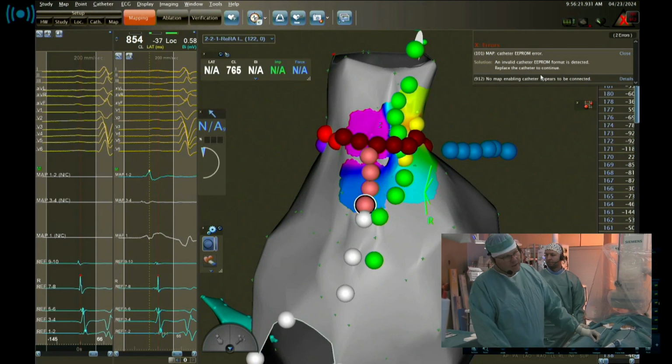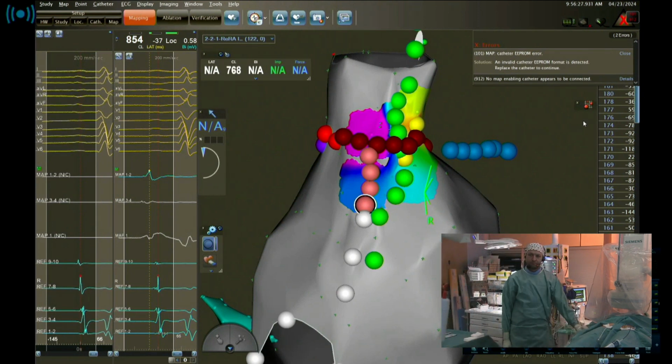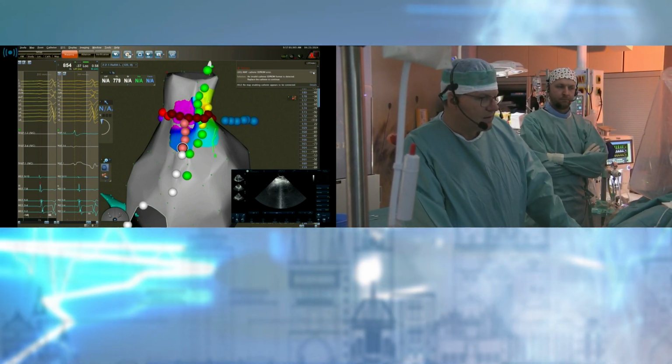Can you hear me? Yeah, I can. Okay, so actually, for us to explain better, you are saying that you apply on one side twice, right? Yes. Okay. And the pulse field applications are tagged by the pink, or what is the color? Yes. Okay. And in the last, there were four deliveries, and at each side we give two pulses. Doubled. Yeah, exactly. Okay. Fine.